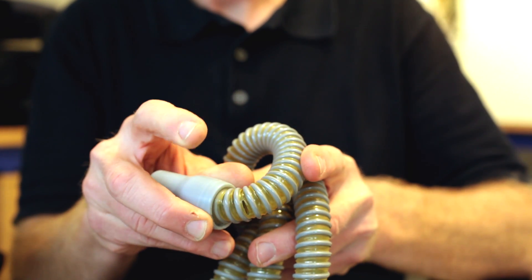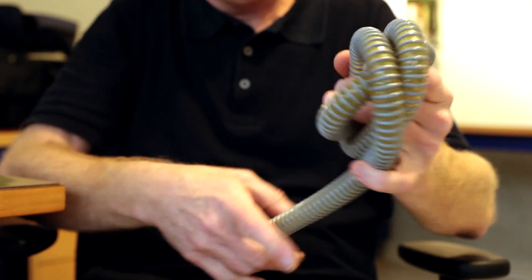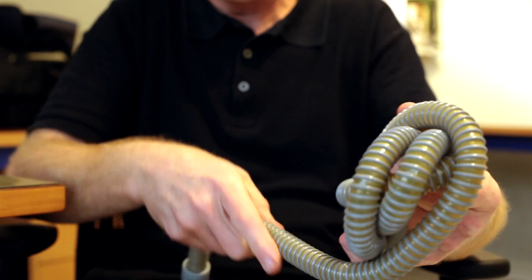It will crush if you apply too much pressure, and of course it is so big it takes as much space as the CPAP itself to pack. So we have a packing problem. My name is Noam Hadass. I am an electronics engineer from Tel Aviv in Israel and I've been developing devices for sleep disorder diagnostics for the past 25 years.